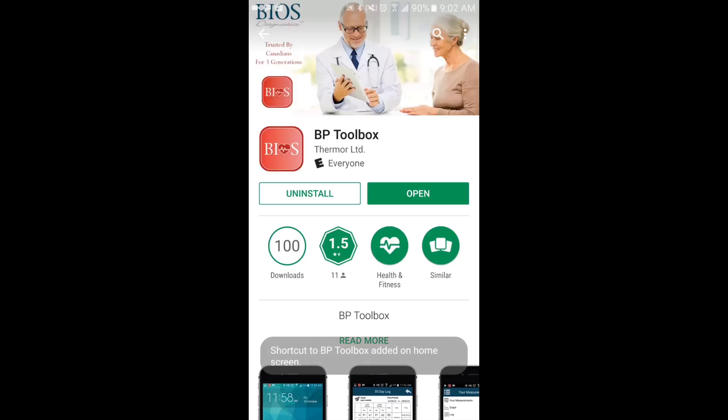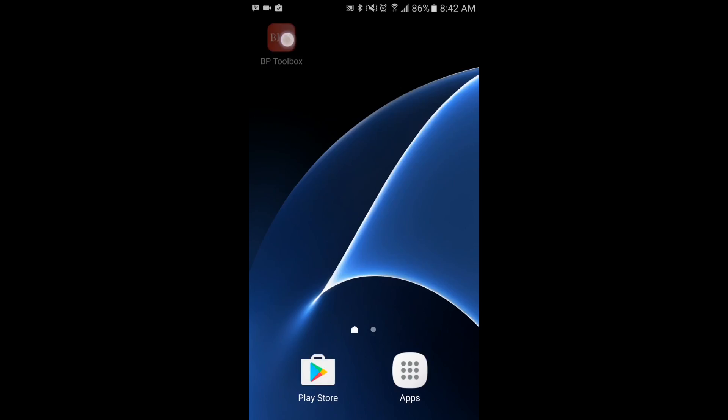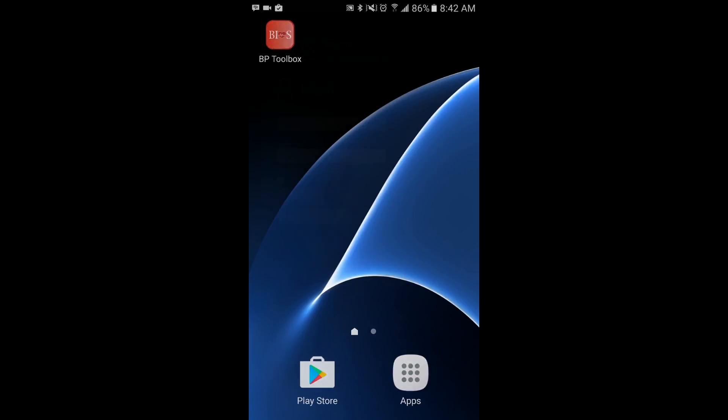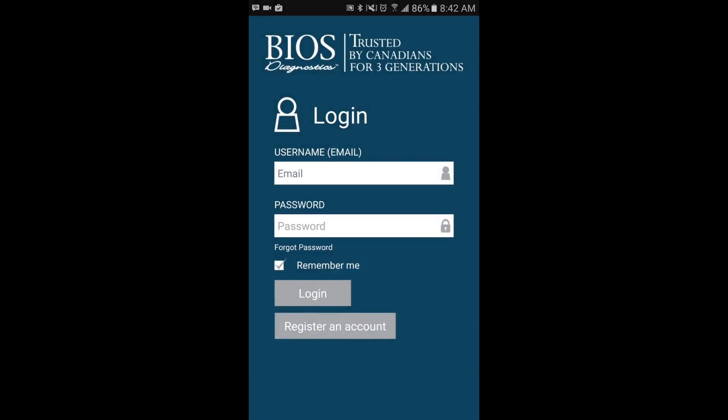You are now ready to start using the app. Once the app has been launched, you will be prompted to log in with the username and password.